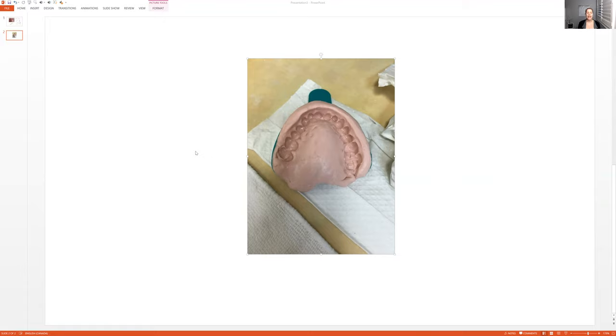And of course, the alginate, probably some extra paper towels because it might get messy, and the impression trays. Grab an upper and a lower, at least a couple different sizes. That's what I do.